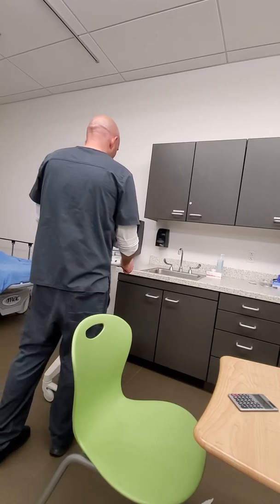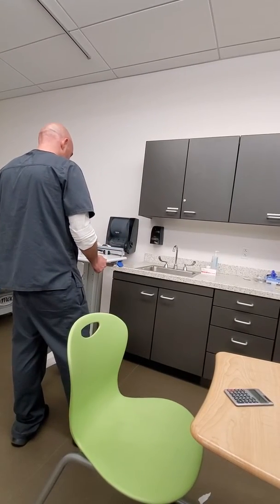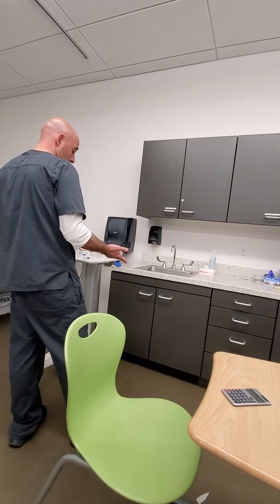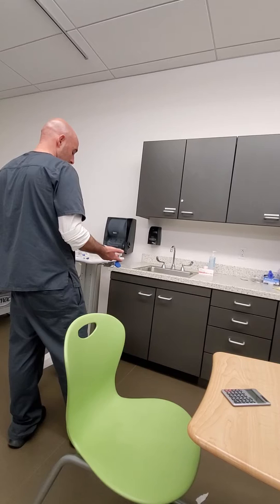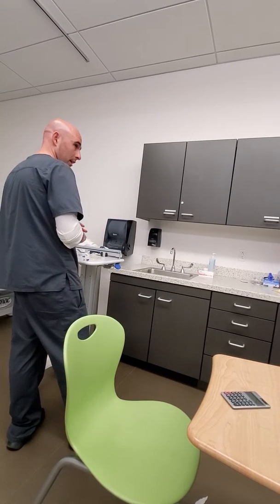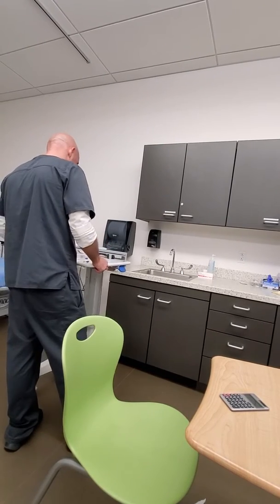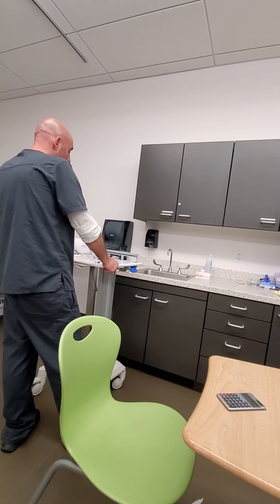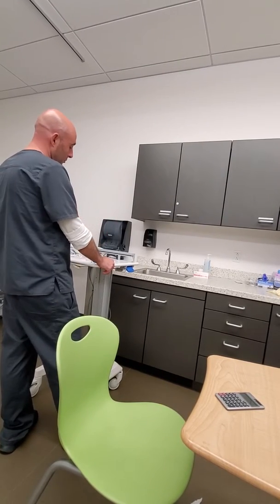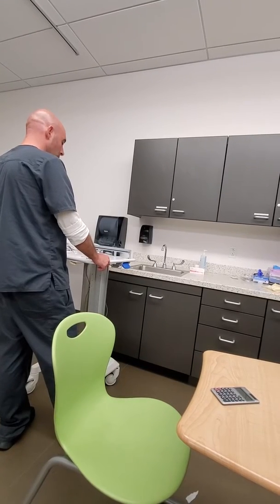What else do you want to check? So you have the right patient, the right med, the right dose, the right time. I want to check where I'm administering this, what part of the body, if it's a central line or a PICC line. Will there be any difference? I'm going to have to flush either, but I have to check on my computer to see where this heparin lock is.